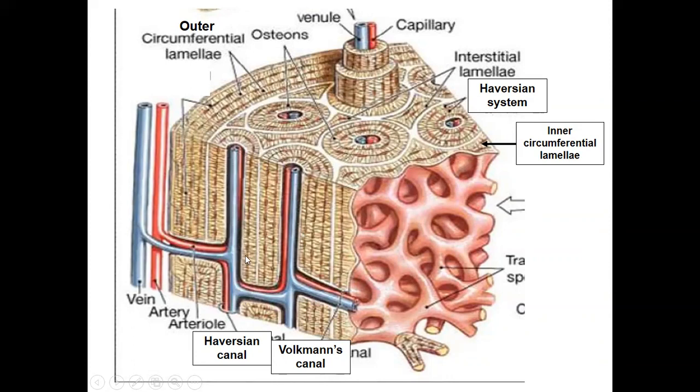So I would like to repeat, and I want to correct here. The longitudinal canal here is the Haversian canal, and it is connected to each other by the transverse canal here, the Volkmann canal. That is regarding the canals.